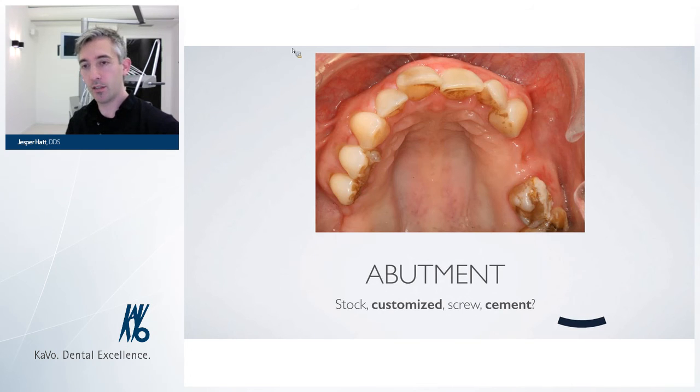She got a condylar fracture in the left side of the mandible, and a couple of fractures of the lower teeth. So here it was a collaboration between our office and some maxillofacial surgeons in the hospital. The maxillofacial surgeons grafted the area distal to the premolars in the right side of the jaw and placed the implants there, while we placed the other implants.